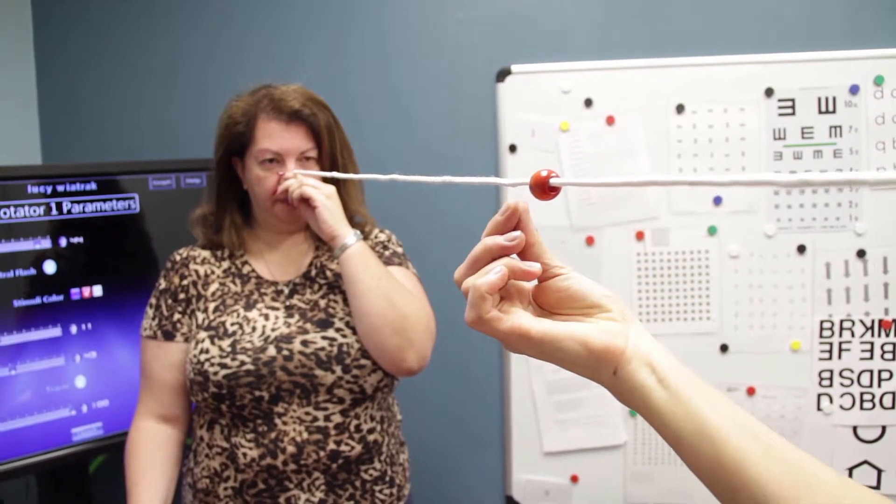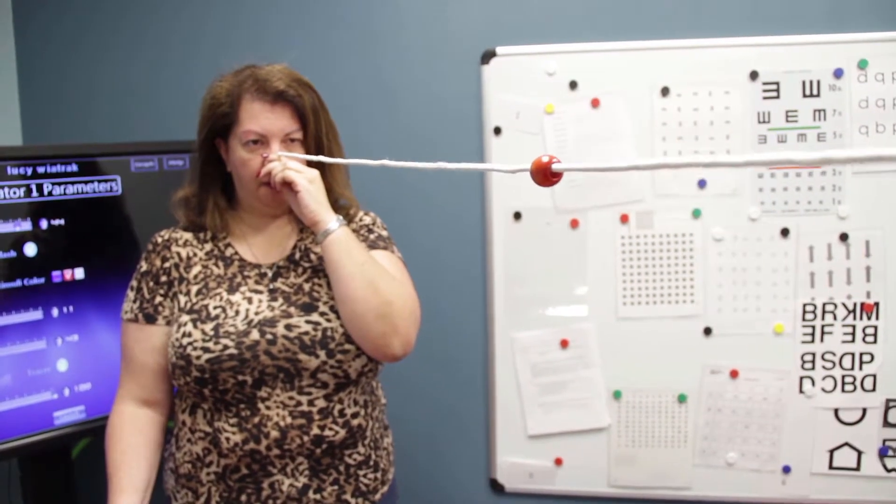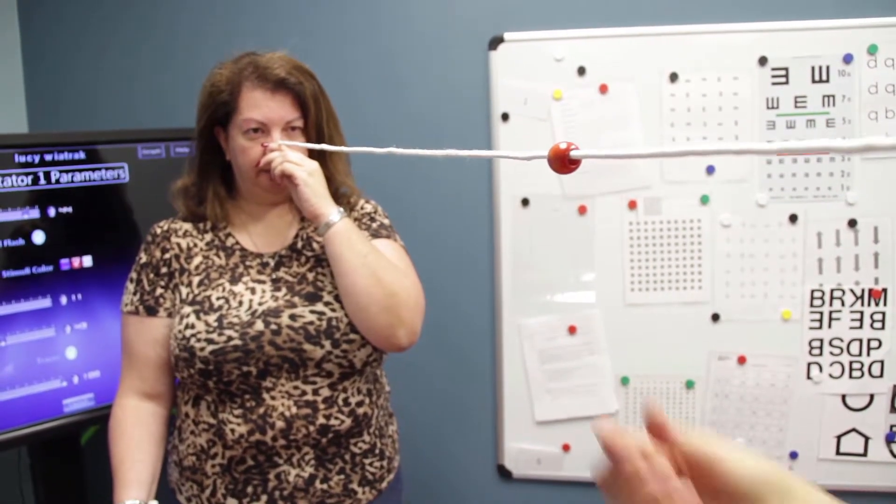You have the two strings going into the bead and two strings coming out, but it's not crossing exactly here. Right, and now I completely lost it. You completely lost it.